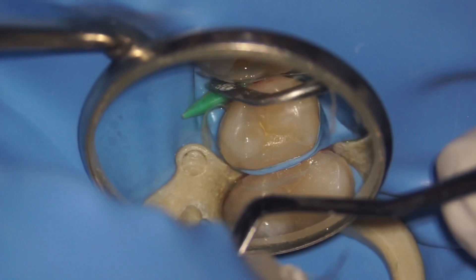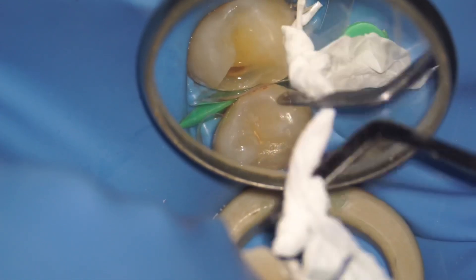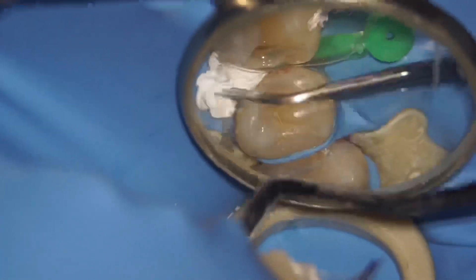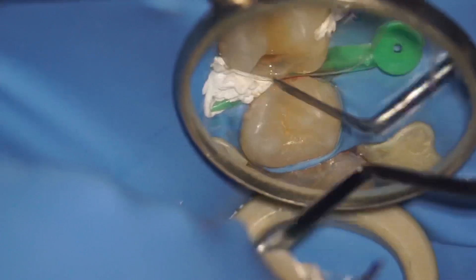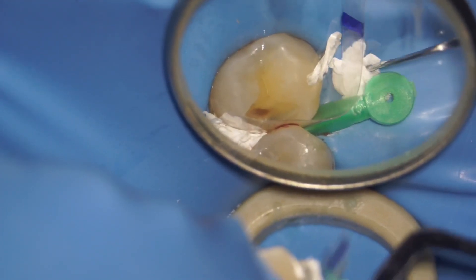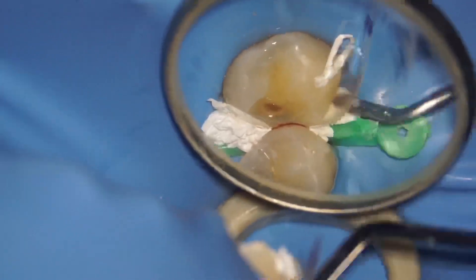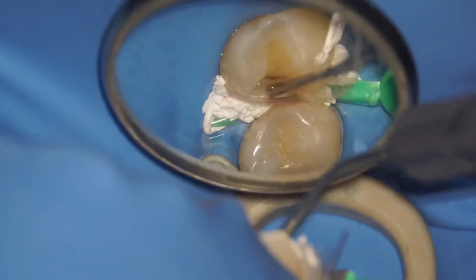There's blood, but no blood is seeping through because the wedge is holding it so tight. You can see me playing with the plastic filling instrument to check if there's any leak. I'm going to use a Teflon strip to adapt the clear matrix well to the enamel on both buccal and lingual sides. A quick tip: wet your plastic filling instrument so you can adapt the Teflon well, as this will help the Teflon not stick to your tooth.